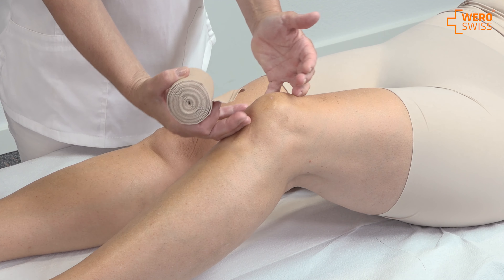I'm going to cover the patella. I start on top of the patella, the leg is slightly bent, and I use the bandage with two circles over the patella.